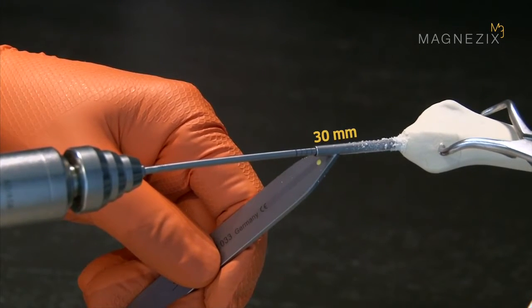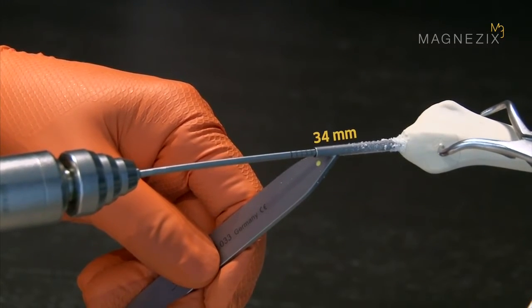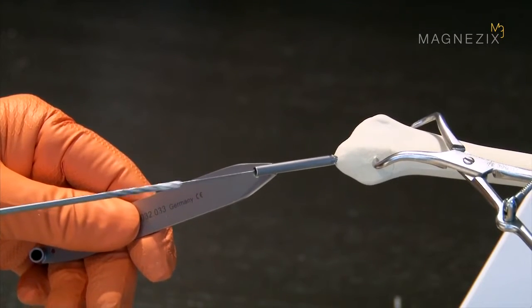Once you've finished pre-drilling, leave the drill bit turning slowly in a forward direction and pull it out vertically from the drill guide to ensure that the guide wire remains in position.